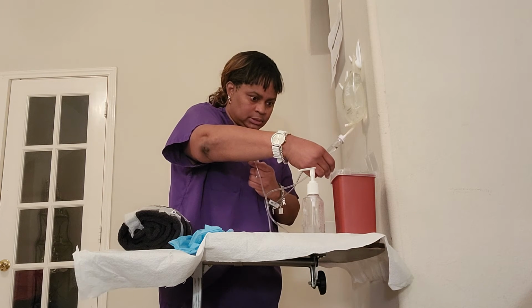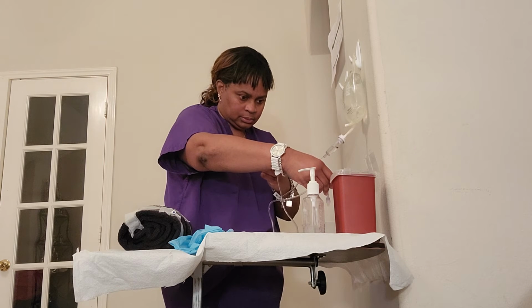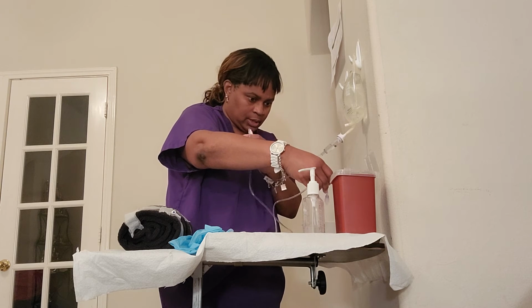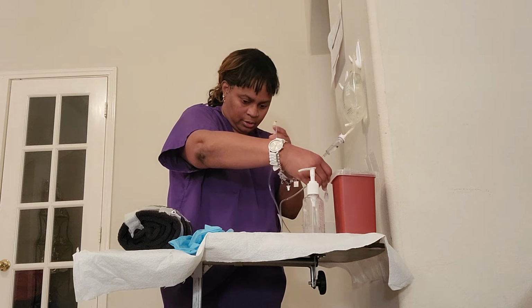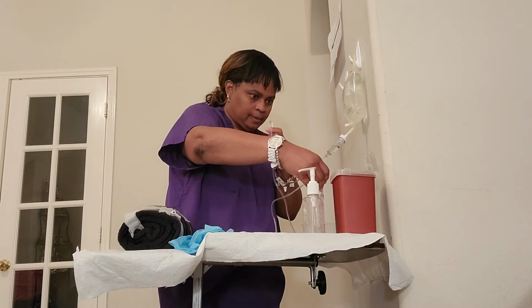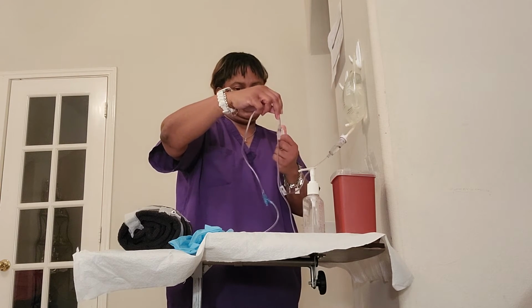Minimal bubbles. Very good. Okay. And there we go. All right, so now I will tighten back up the tubing.